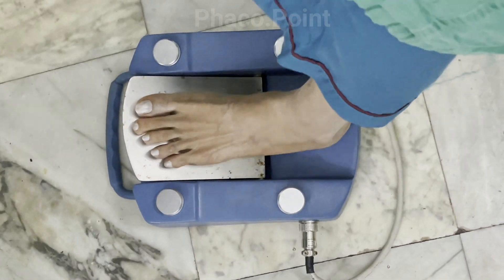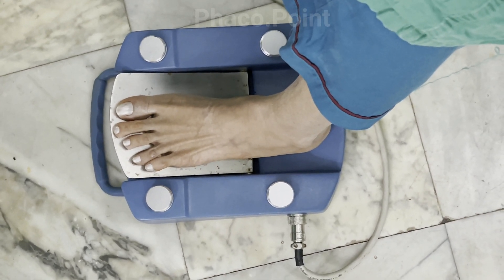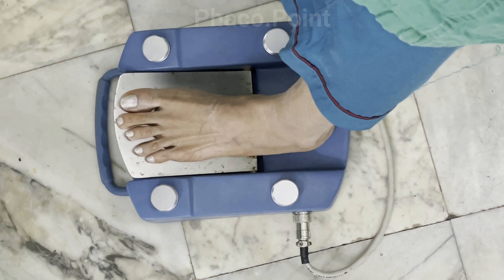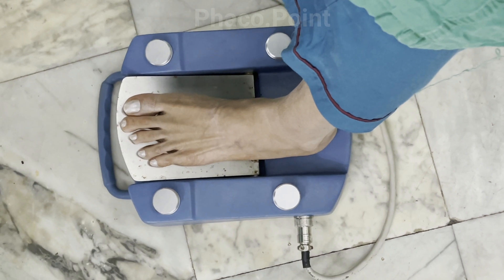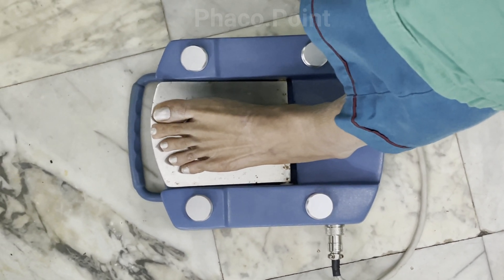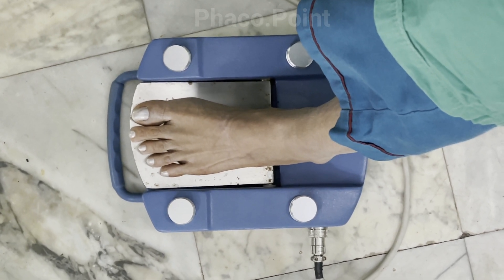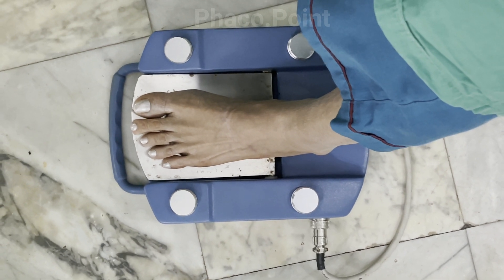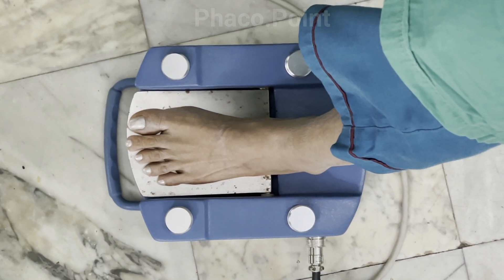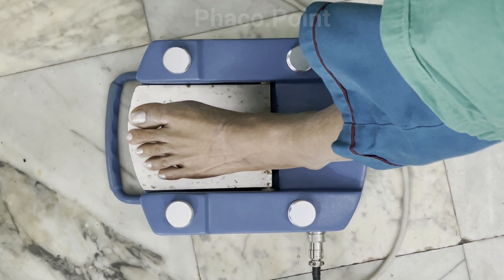Moving on to the foot pedal itself, we need to understand the quantum of movement to go from foot pedal position 0 (nothing), to position 1 (start of irrigation), to position 2 (aspiration), and then to position 3 (FACO). Learn the auditory signals on your particular machine. On this machine, position 0 is silent; a slight depression starts irrigation with a beep sound; further depression gives aspiration with a continuous buzzing sound; and full depression enters foot pedal 3, which is FACO.